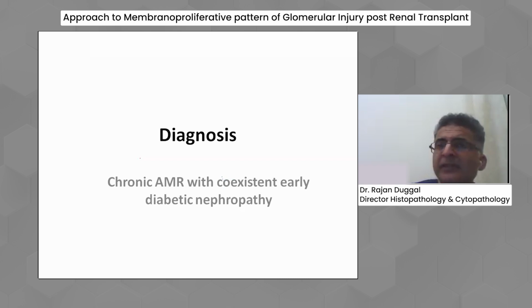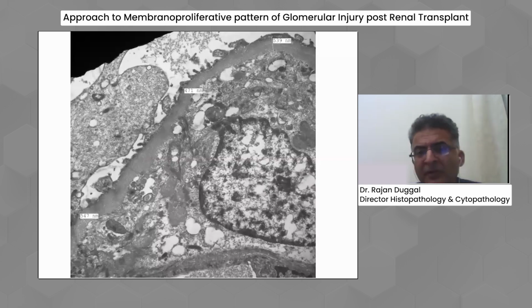And we should say that it is chronic AMR with secondary FSGS lesion rather than labeling that as a podocytopathy, which will be an incorrect diagnosis. The other thing is we have also seen, so I'll show you the previous images. So we have also seen, like in this case, you can see these podocytic foot process projections. So there is preservation of podocyte foot processes at areas.